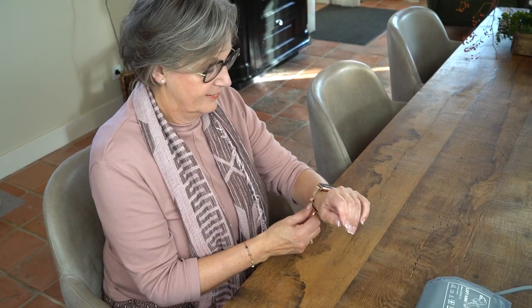Before you measure, sit still and try to relax. Take a few deep breaths. Remove your watch, bracelet, or any jewelry from your left arm.